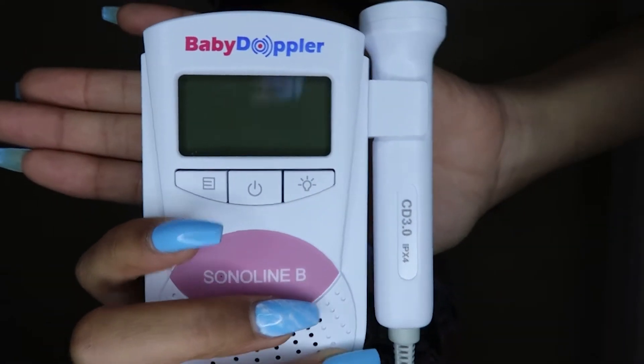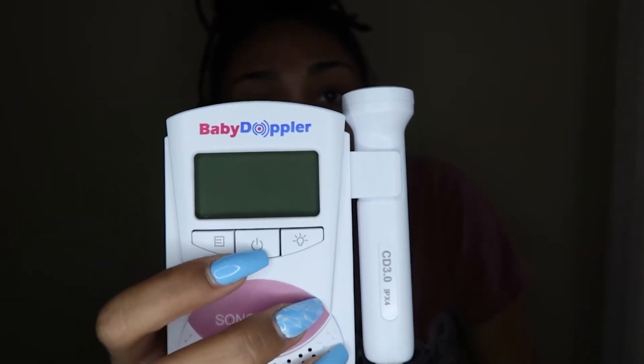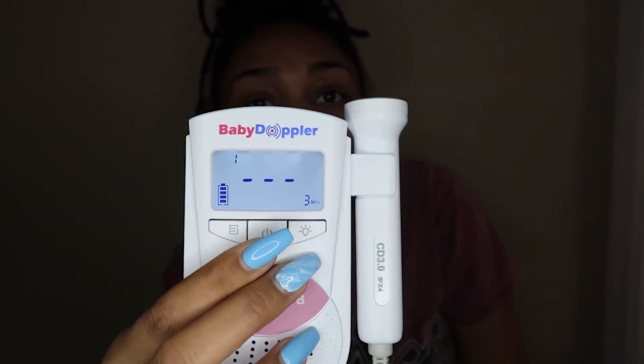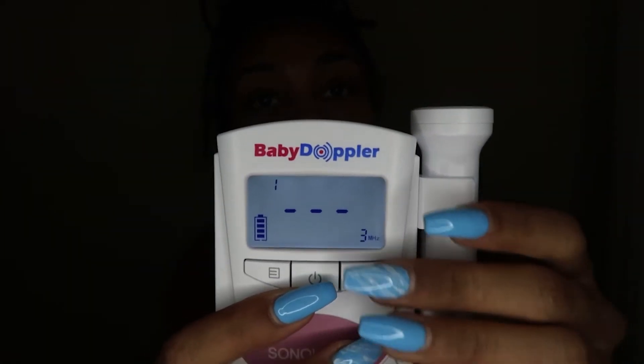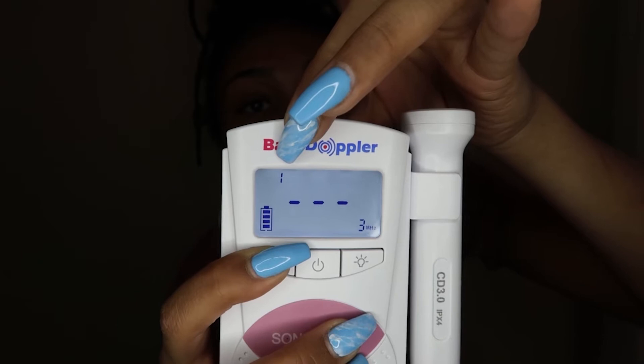So first, there are three buttons. I'm not sure what one of them is — I've got to look it up again. There's the power button in the middle and there's the light. You want to hold the power button and it'll turn on. You have different numbers at the top: one, two, and three. Always turn the volume down as soon as you turn it on because it's so loud.